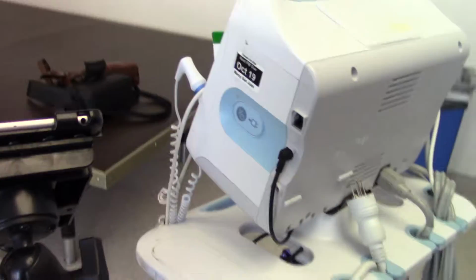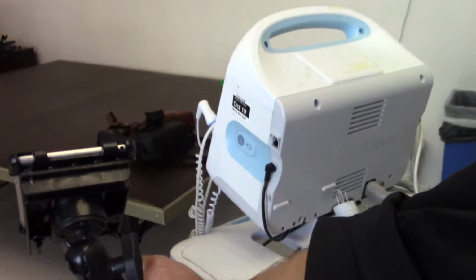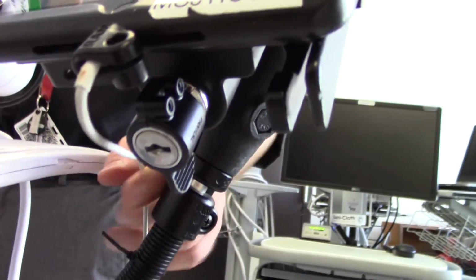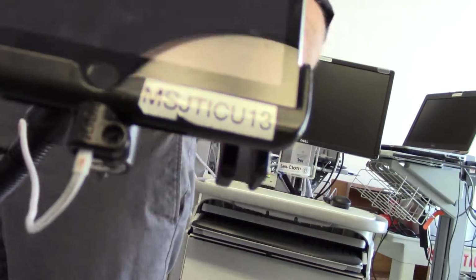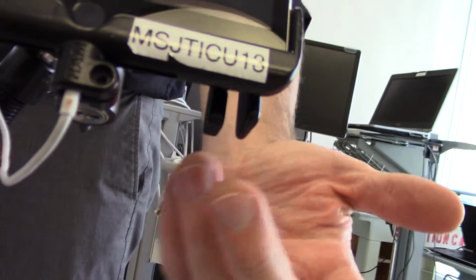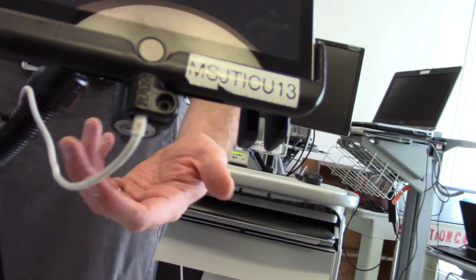Okay, that's great explanation there. The other issue you can see is the iPad cable is hanging out here, so it comes out at a fairly severe angle. And as you can see earlier when I was twisting it around, it gets tensioned pretty tightly. Oh, I see. And so a lot of wear and tear right here at the jacket. Which creates exposed wiring, which is an issue, a problem on a patient care device.